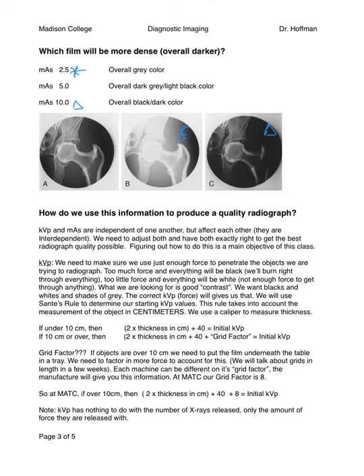So my next part I have for you guys is how we produce that quality image. I'll let you guys read through that. I've talked a lot about what I've already written there in this last 10 minutes you guys have been listening to me talk. And this is also where I introduce Sante's rule for you. I have a whole other video that you guys can click on where I go through Sante's rule and really break it down for you guys. So I'm going to skip over that one for this video as well.